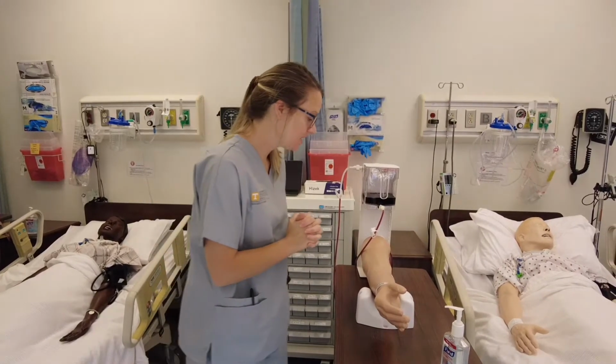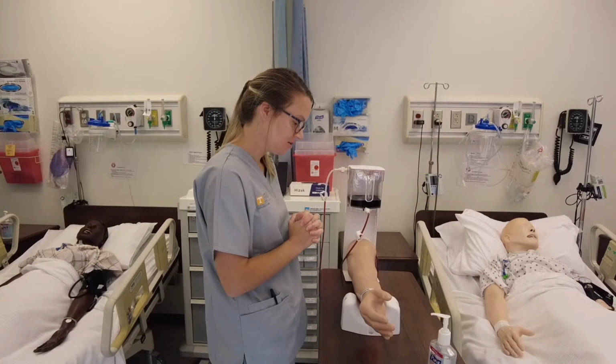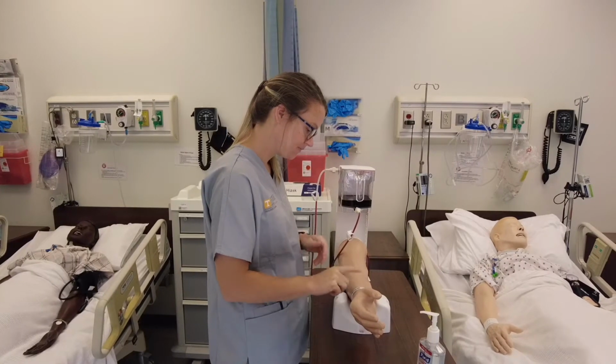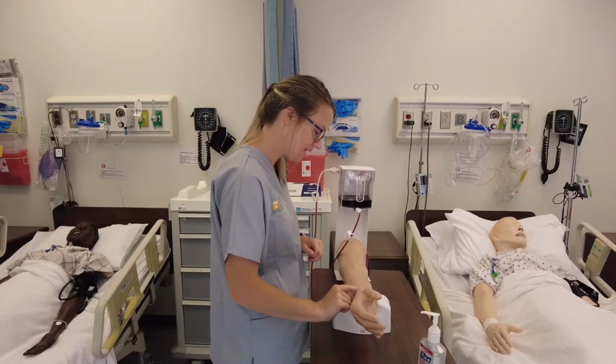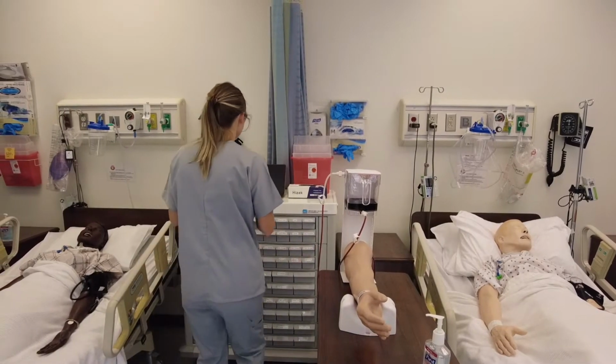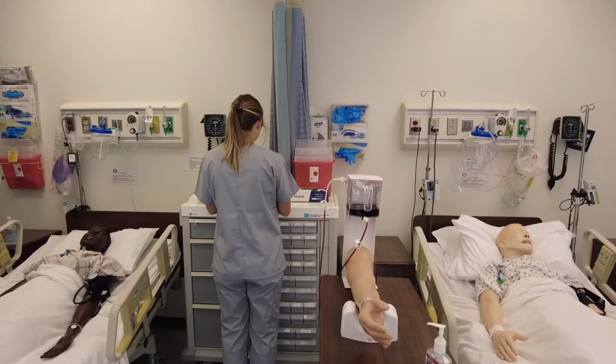Hi, Ms. Smith. My name is Abby. I'm going to be your nurse today. We are going to be starting an IV in your arm. So if you could go ahead and give me your name and date of birth. Susan Smith, 7/24/69. And do you have any allergies? Nope. And I'm going to check the computer here to make sure you have no allergies.